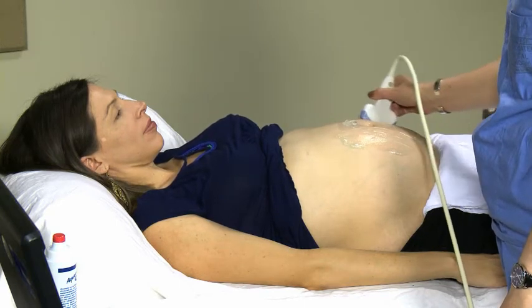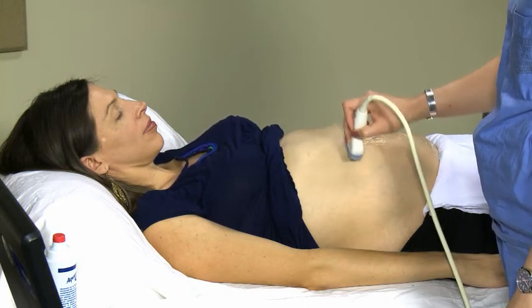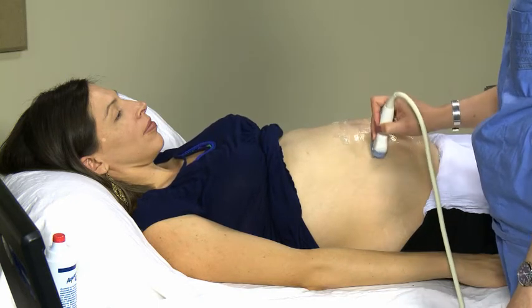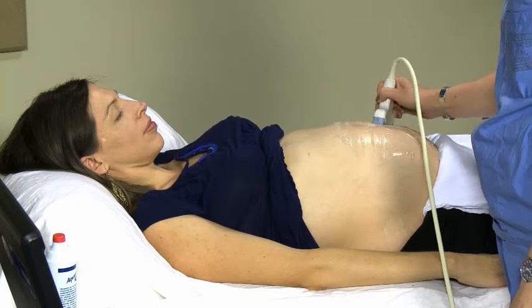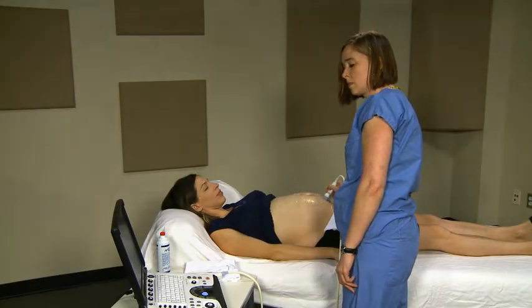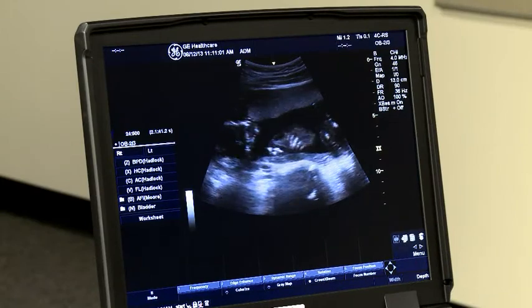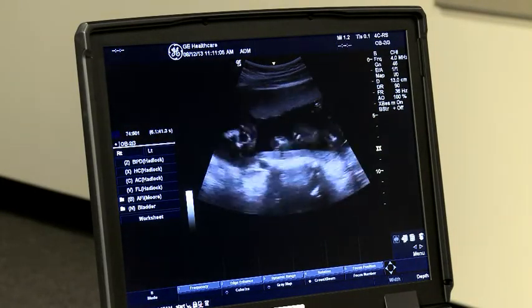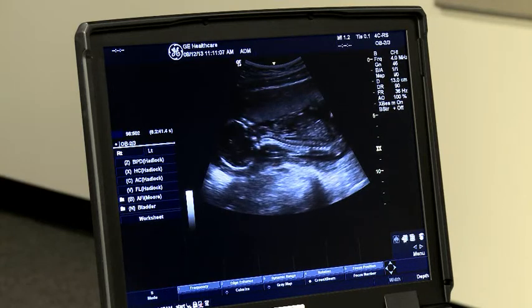Here you can see the ROBUST technique being utilized. It includes three upward sweeps across the abdomen from bottom to top, followed by three sweeps across the abdomen from right to left. These sweeps across the abdomen will help you quickly determine the fetal position, the placental location, and if there is more than one fetus present.